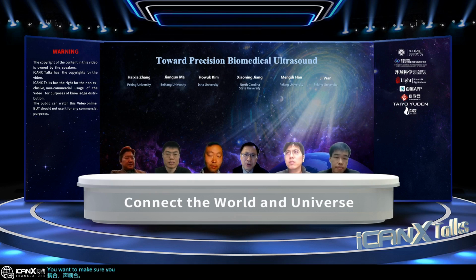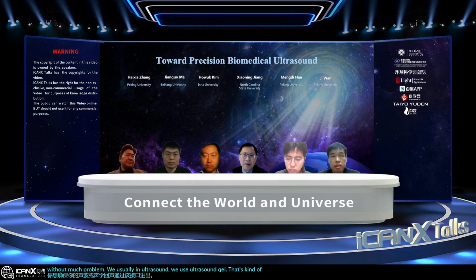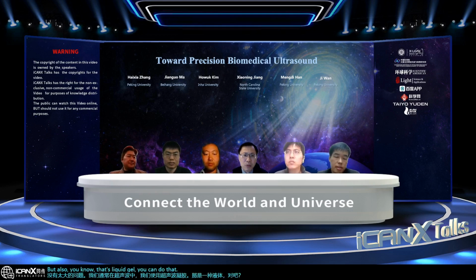You want to make sure your acoustic wave or acoustic echo comes in and out through that interface without much problem. In ultrasound, we usually use ultrasound gel. That's kind of liquid, right? You can do that, but that's not good for wearables.